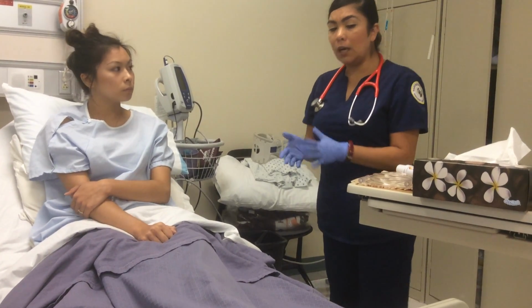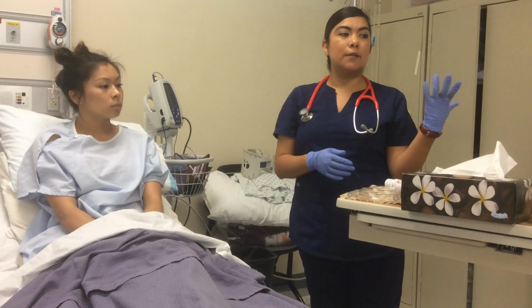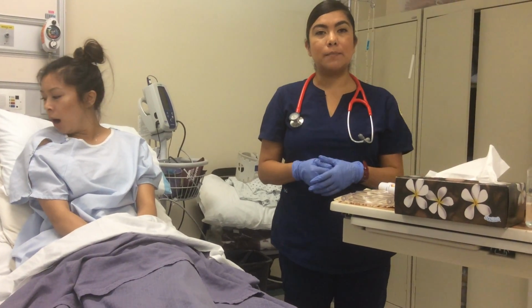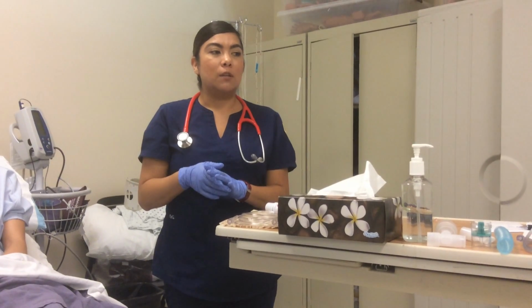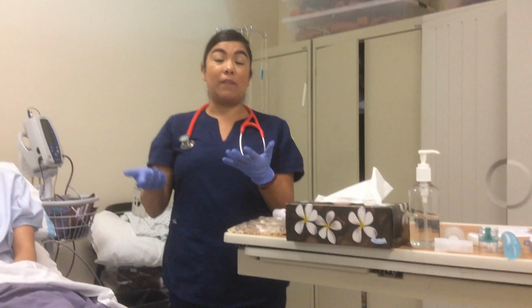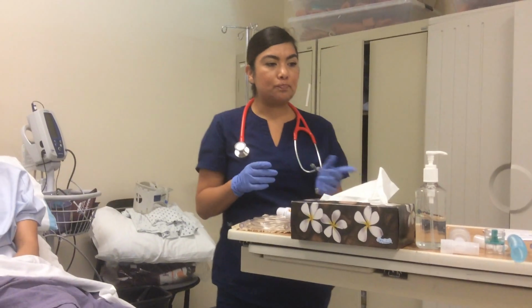Now, we're going to be using a mouthpiece, and the reason that we're going to be using the mouthpiece is because with a face mask, the aerosol could go into the patient's eyes. Also, the long period of time of the medication. Okay.